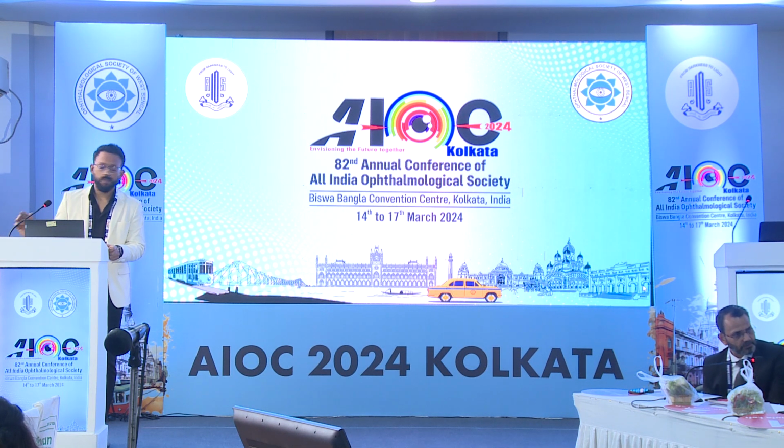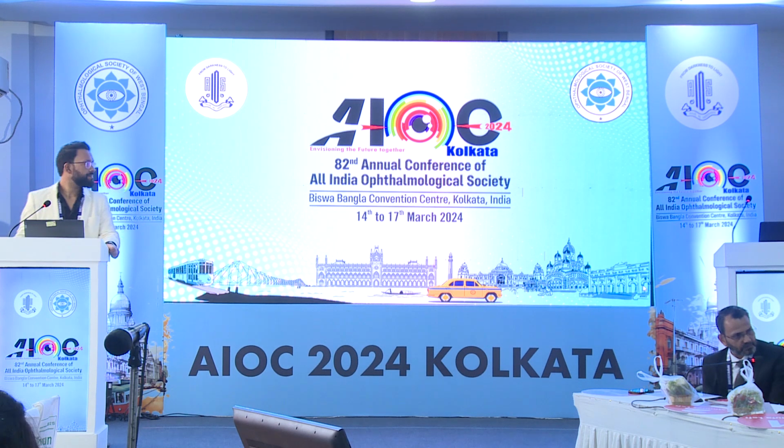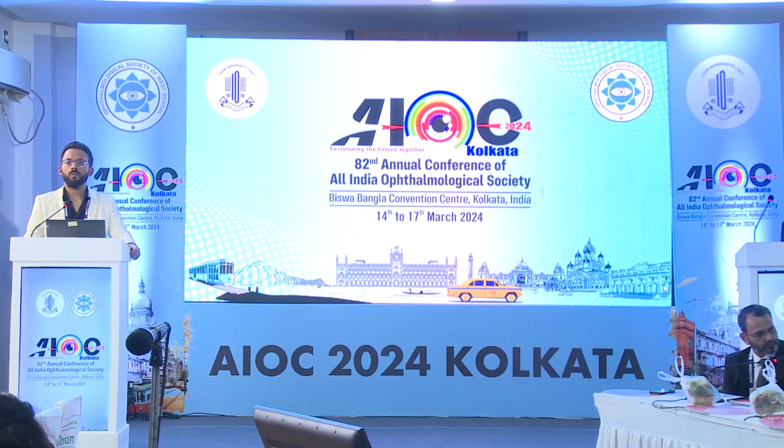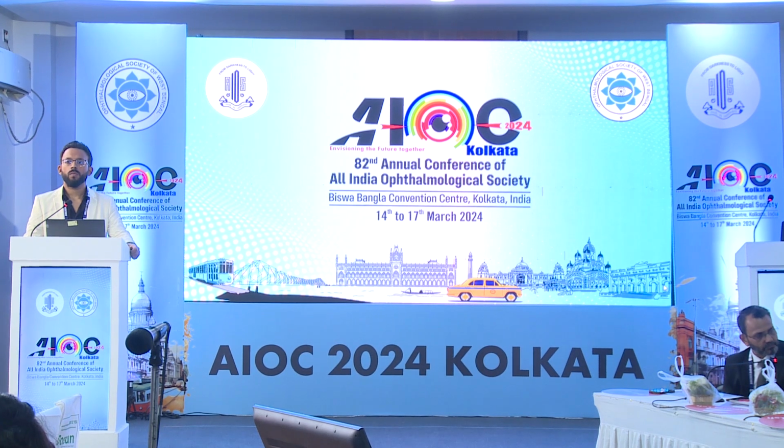The patient, after 4 months, will remain asymptomatic. What you see is a definite change in OCT. There will be an ellipsoid cavity there.